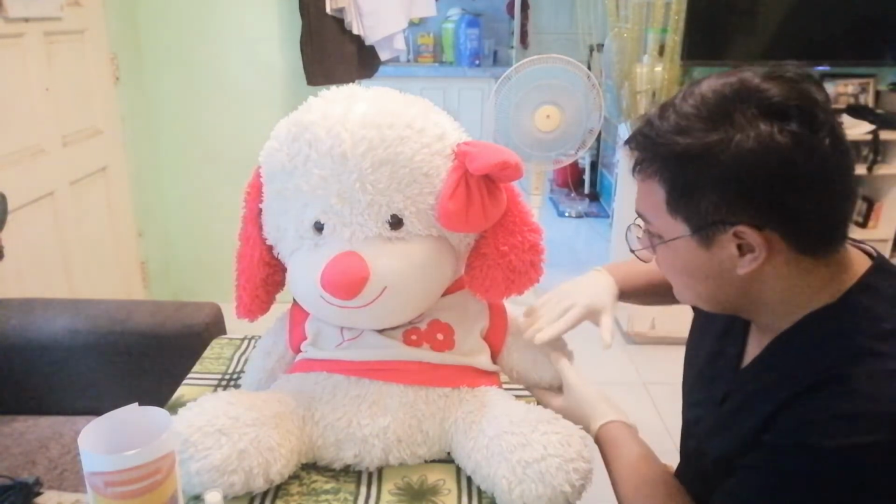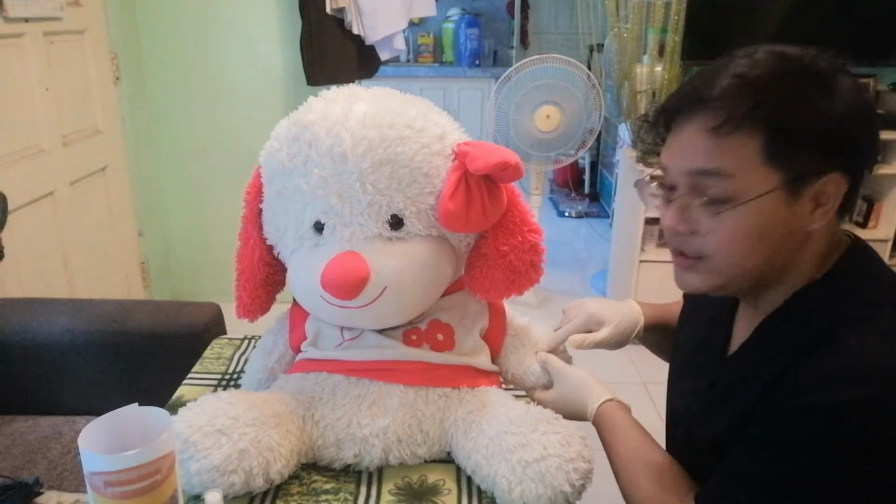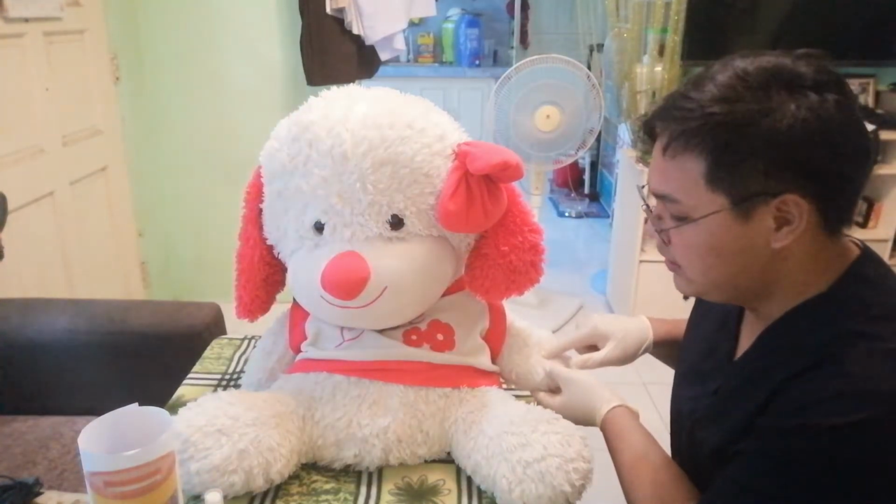Okay, now that we're done, we'll now proceed to our next step, which is we need to select the site or the area on the inner aspect of our patient's forearm. And it is exactly 4 fingers away from the patient's AC. So here, for example, we'll be injecting our client here.